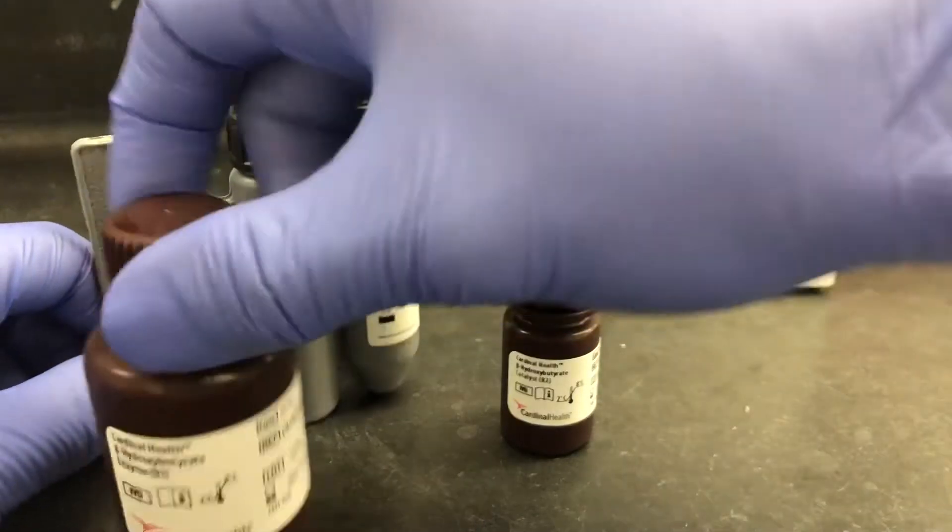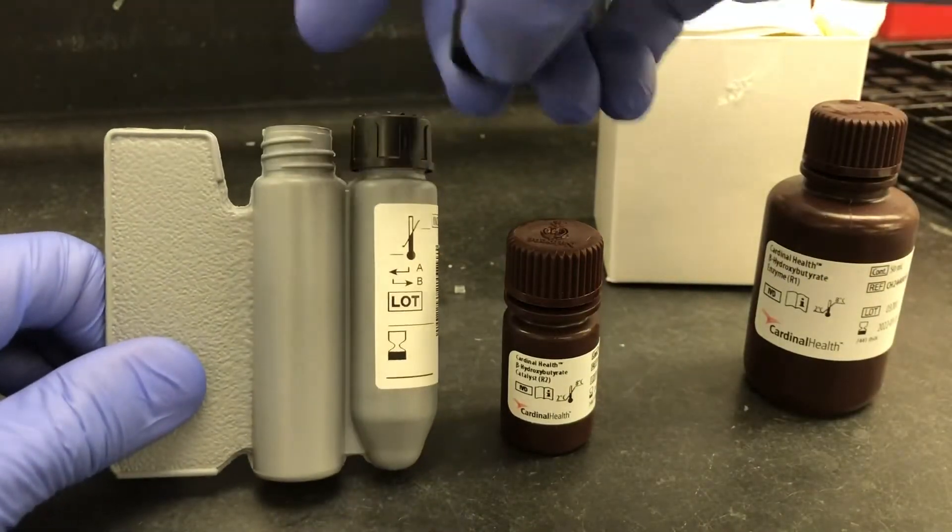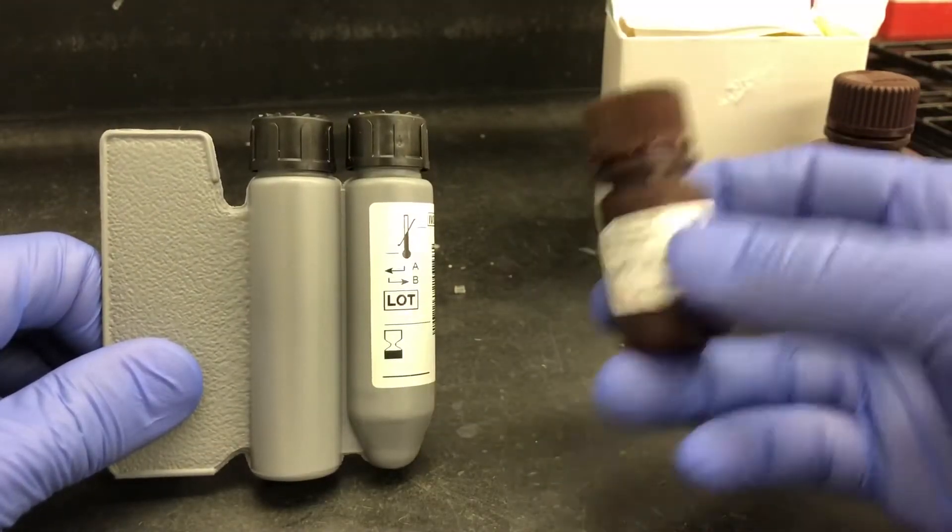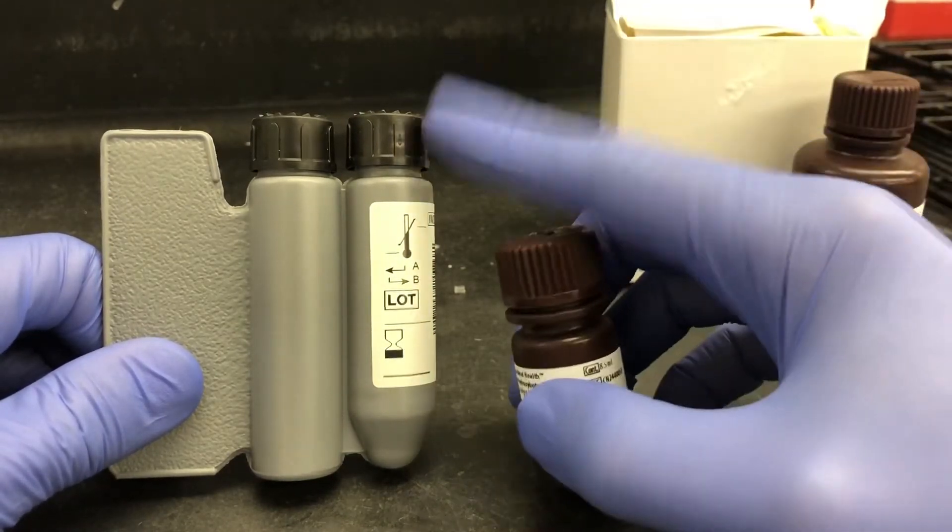So when you go to fill these, you're going to remove the cap on the user-defined reagent pack, and you would fill it about a quarter of an inch from the top. You would do the same for reagent 2 on the R2 side.